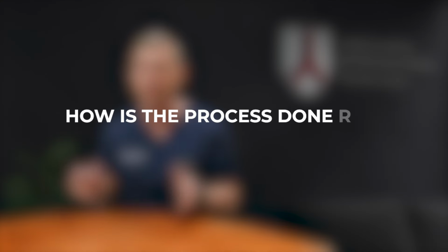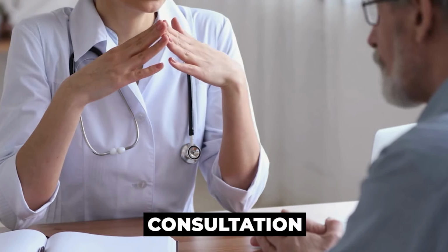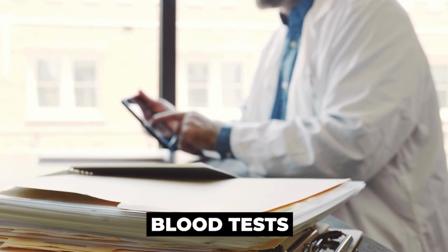So how is the process and what should you expect? Well, we start with a consultation where we'll review with you your imaging, including CTs, MRIs, ultrasounds, and blood tests. We'll also analyze your whole medical situation and make sure you're fit to undergo this procedure. And the truth is, most patients can tolerate this procedure.